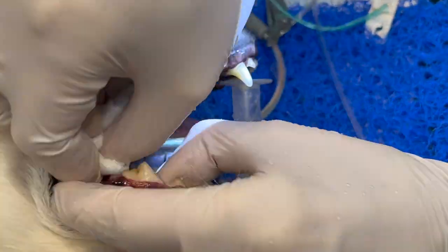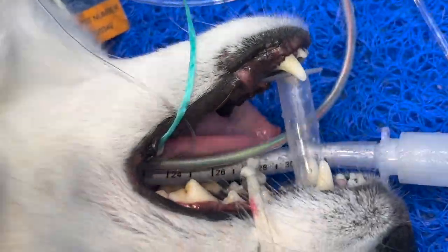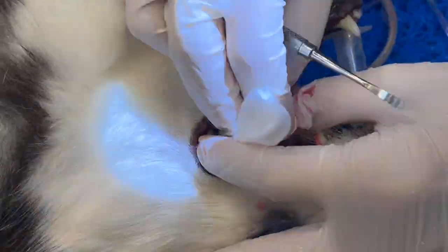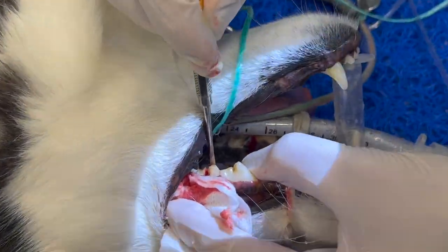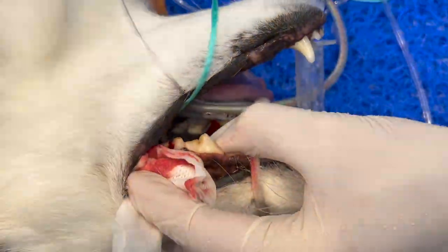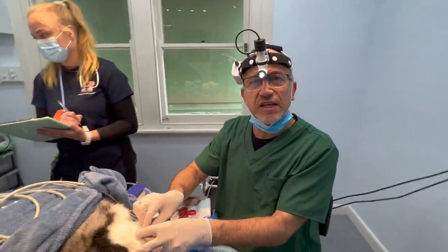What we've done, really simply, is we've cut this tooth — first longitudinally, and then horizontally. So I've broken the tooth into three single-rooted teeth, and then I'm going to gradually, slowly take out each of the single roots.